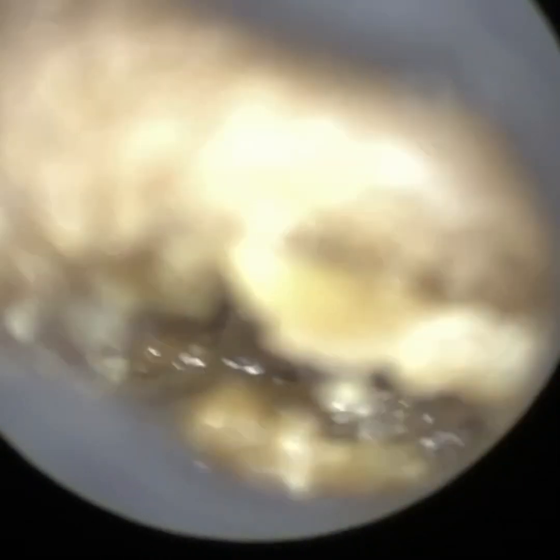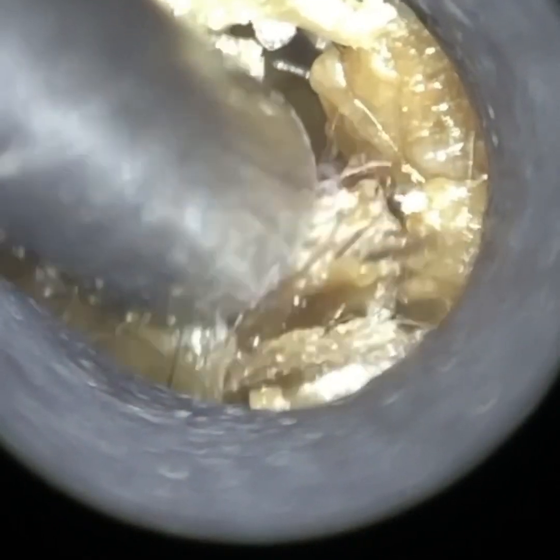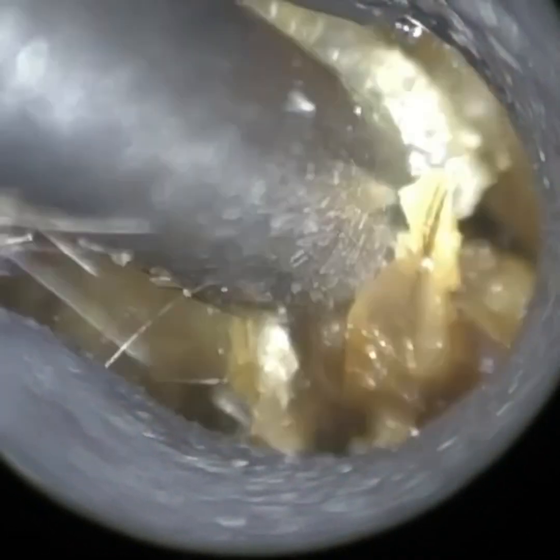Hello, this is Mr. Neil Reiteter, consultant audiologist and director of Clearwax. Thank you for joining me in another demonstration video of our recently developed Waxscope. The Waxscope is due to be launched early autumn 2022, so if you are interested, please do email info at clearwax.co.uk.